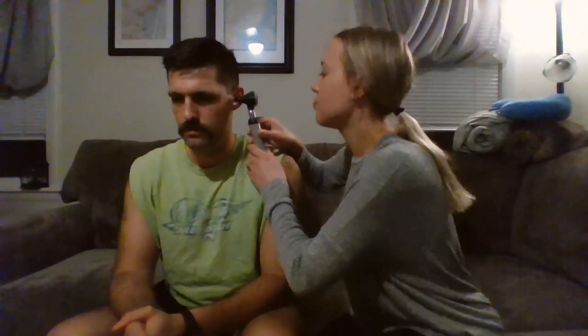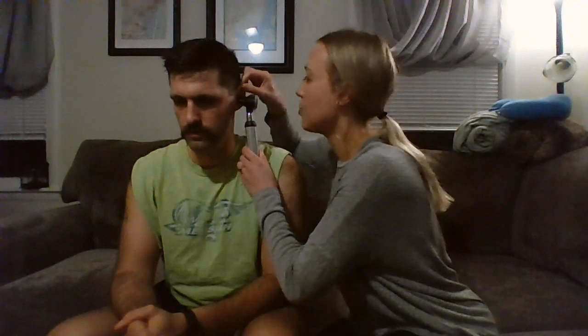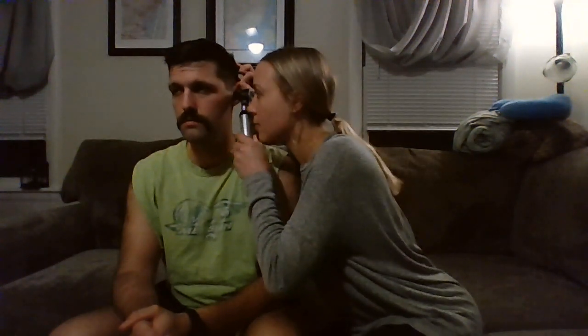So we're going to take a look with the otoscope here, take note of the external auditory canal. And then we're going to pull up and back the pinna. I'm going to take a look here. So we can see some cerumen in there, but we can see the tympanic membrane is pearly gray.